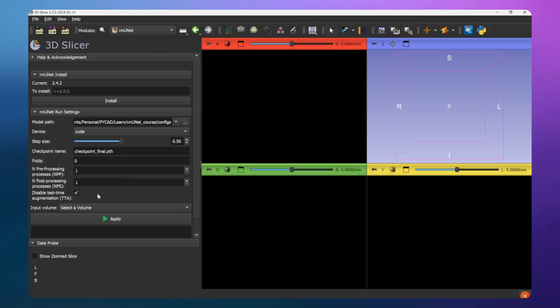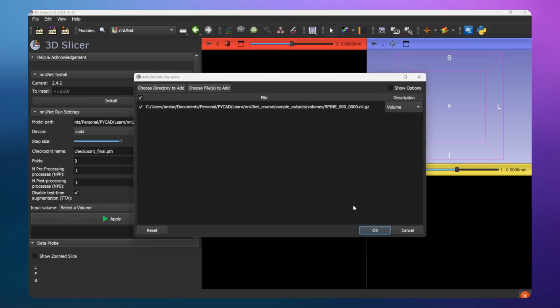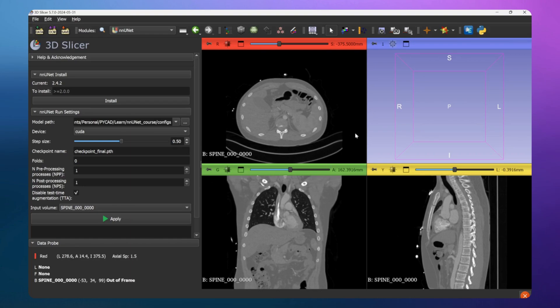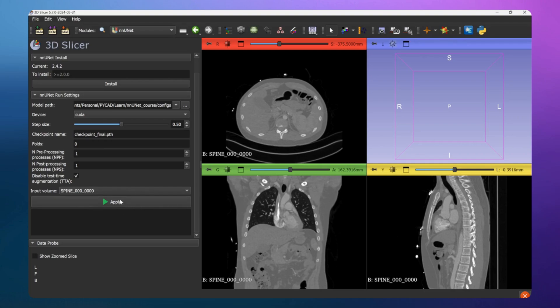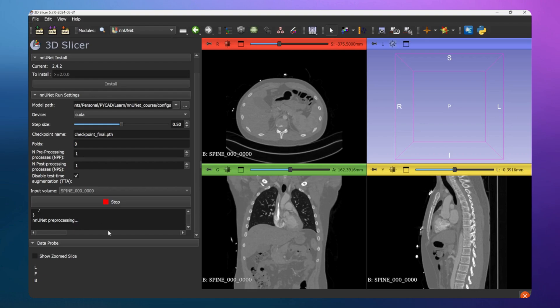Now open your volume file. Let me open this scan - it's one of the scans we used for validation in our training. The extension will automatically detect the loaded volume, but if you have multiple volumes open you can select which one to use for inference. Once ready, just click Apply to run the inference. You can see the logs here, the same logs you'd see in a terminal.